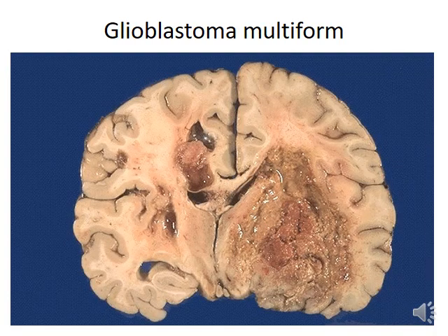Macroscopic picture of glioblastoma multiforme. It appears here as an ill-defined mass arising in the cerebral hemisphere. Cut section is soft, friable, with areas of hemorrhage and necrosis. It's a very aggressive tumor, thus it's WHO grade 4.